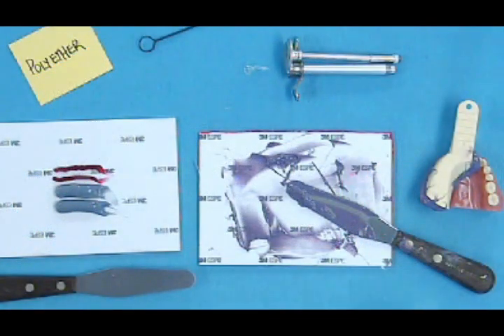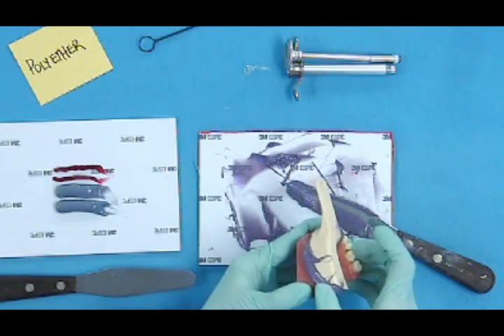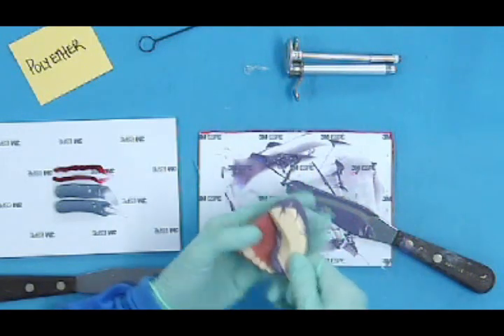Okay, we've waited long enough for the material to set. And it can be removed from the patient's mouth.